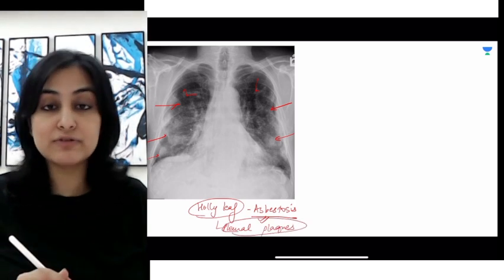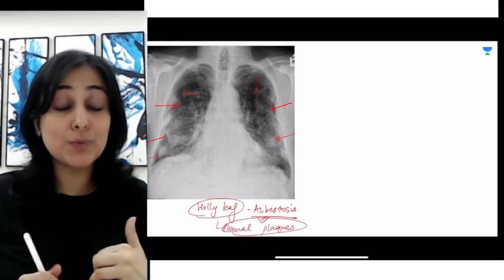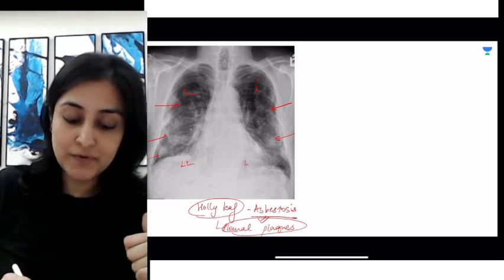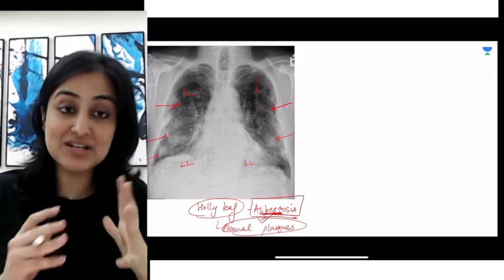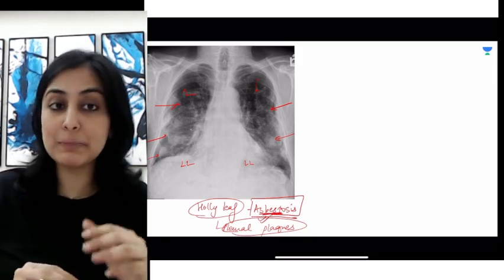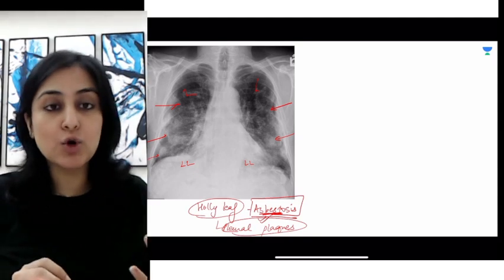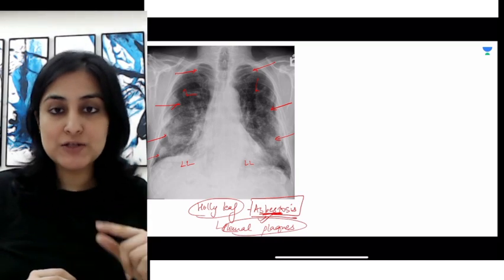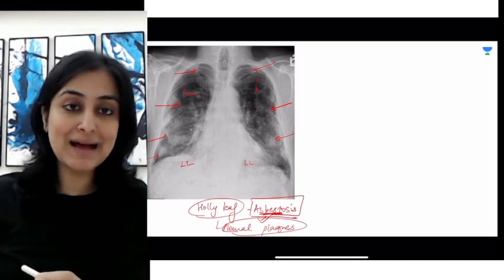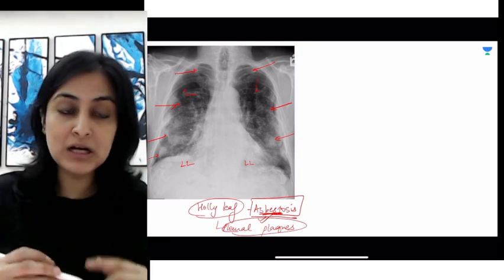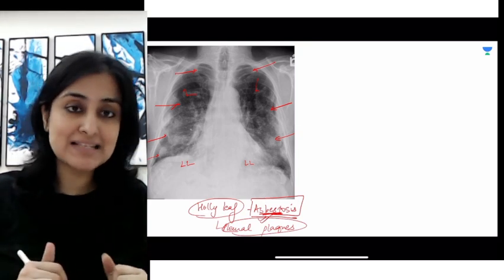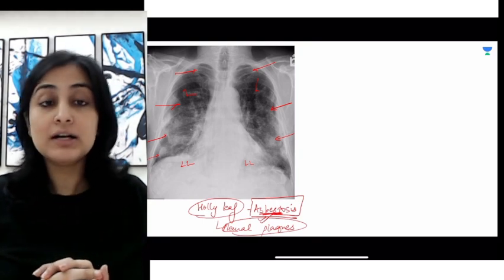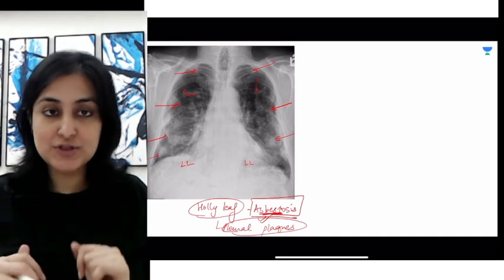Other features of asbestosis include fibrotic opacities and nodular opacities concentrated in the lower lobe. Asbestosis, as the name suggests, is more common in the lower lobes, whereas all other occupation-related diseases have an upper lobar predilection. A more specific malignancy to remember is mesothelioma, which presents with nodular pleural thickening — not calcified — with no mediastinal shift. This is called the frozen hemithorax.